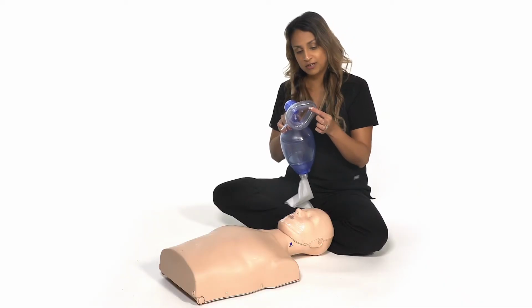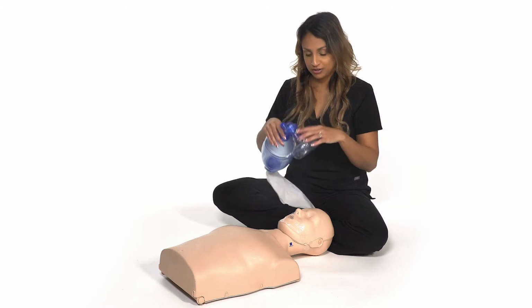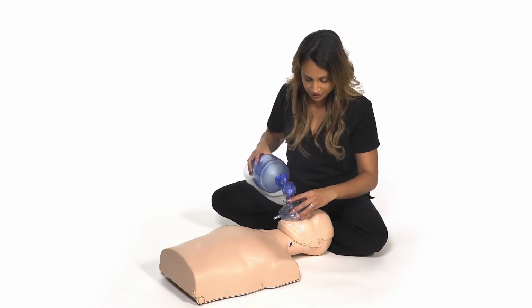You'll notice that one part is pointy here. This will go over the part of the nose, and then the curved part will go on the chin. So we'll place that on the patient.